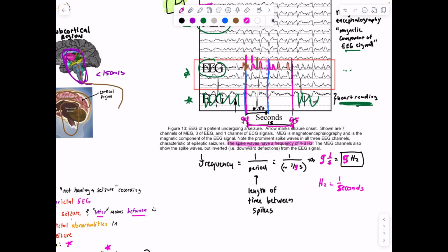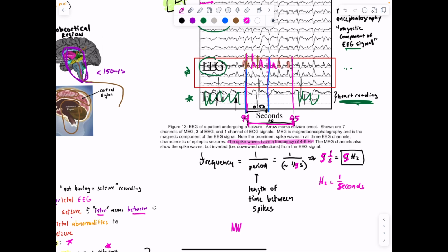This is pathogenic, right? These should not be so spread apart, even though it looks like they're close together. But again, this versus this, right? This bad spike. This may be more normal. All right, so that's it.